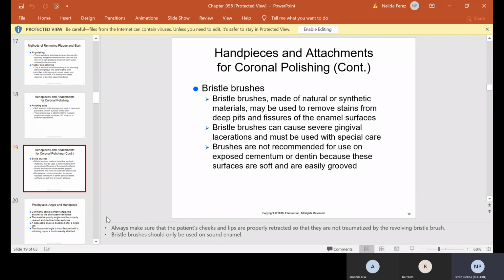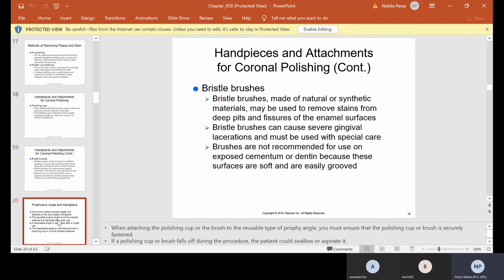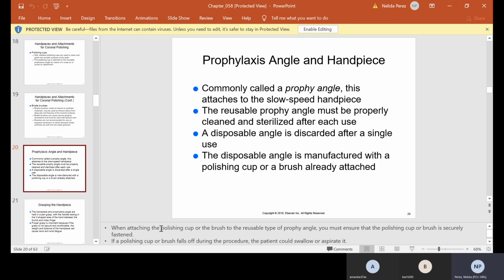Also, I showed you bristle brushes. They could be made of natural or synthetic materials, and may be used to remove stains from deep pits and fissures of the enamel surfaces. They can cause severe gingival lacerations and must be used with special care. They're not recommended for use on exposed cementum or dentin because these surfaces are soft and are easily grooved. A lot of people use them also for ortho to get around the brackets.